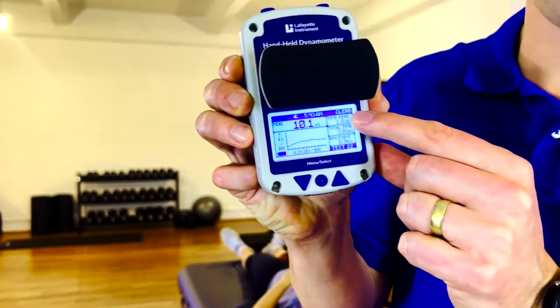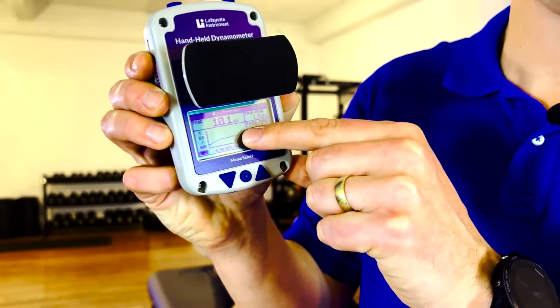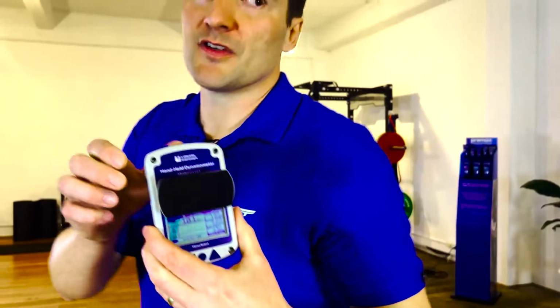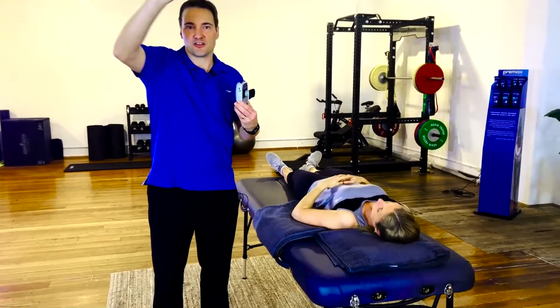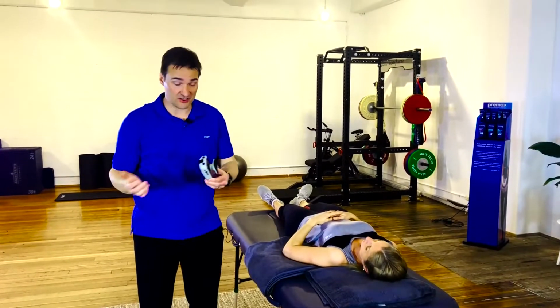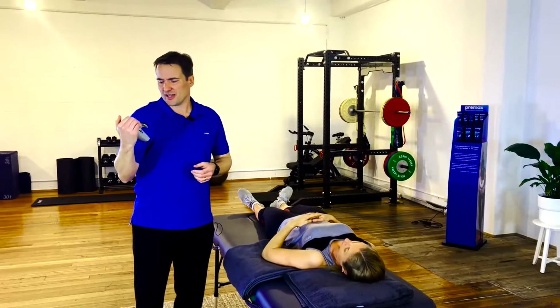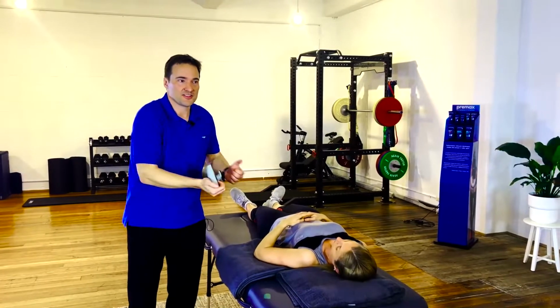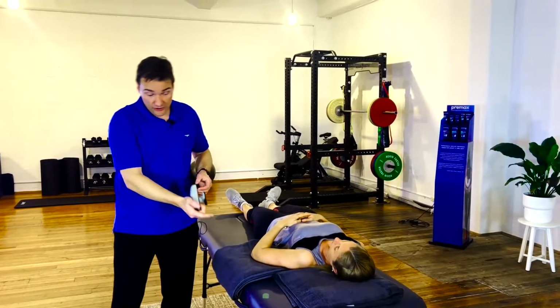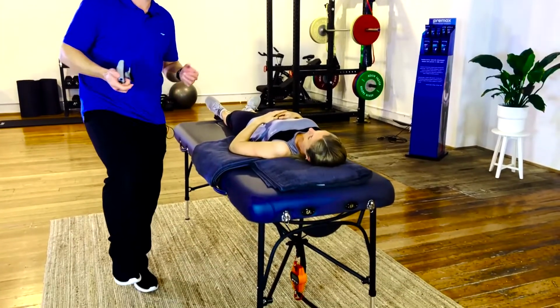The time to peak force is there, but you can see their time to peak force will be somewhere on that plateau. I think that's useful in terms of thinking you do want a stable measure of force. It's peak force, and the more it goes up and down, the more it's probably just picking one of the peaks. Can they sustain that force for 3 seconds is what you're testing. So you can validate it, you can sort of see what they're doing there. Honestly, you can feel that. You can feel when someone's peaking. Not so much when you've got them in a fixed load cell setup, but you can see them as well.